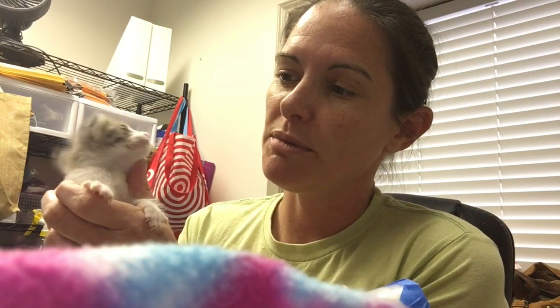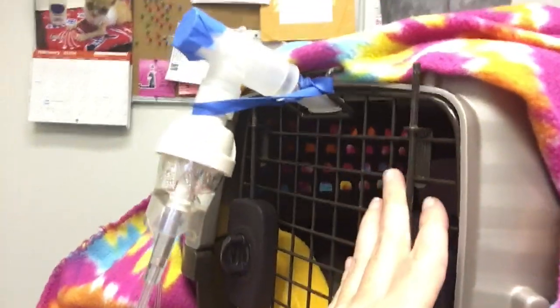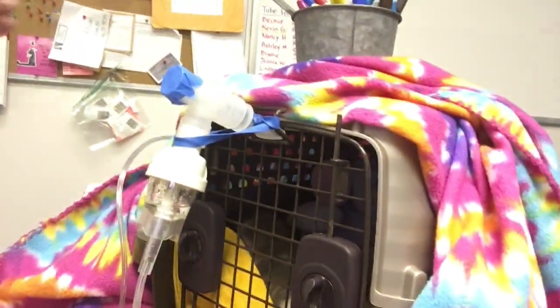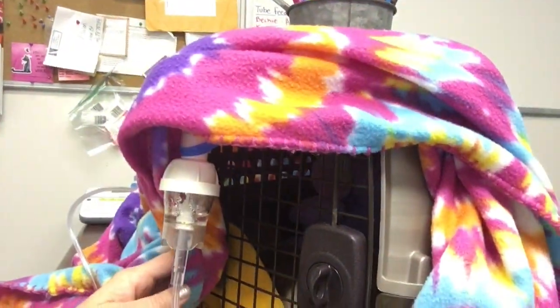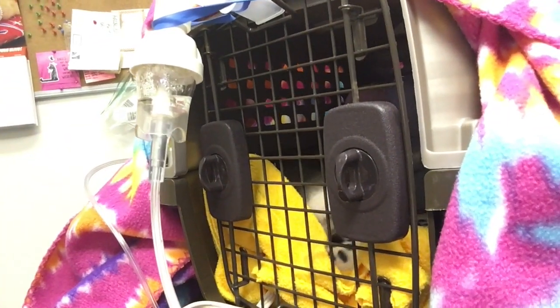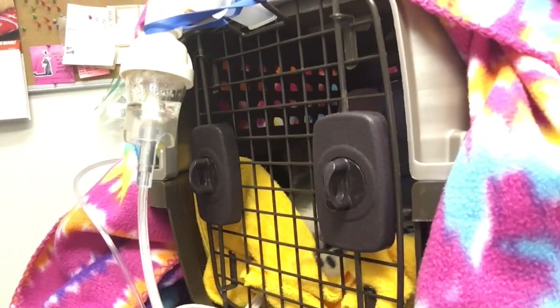There you go — and then you have a full baby. So then you're going to want to go ahead and weigh the kitten just for your records, and go ahead and stimulate like normal. This baby we are also nebulizing — I can show that little setup here. We have a carrier here that we're going to put the baby in, then we close it. We have our nebulizer attached right to the cage so we can cover it all up and get it nebulized. That way it will help open his airways and hopefully we can add him back to his mom where he can successfully start nursing again.